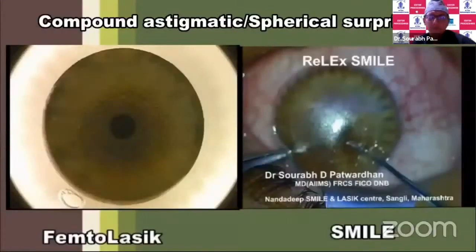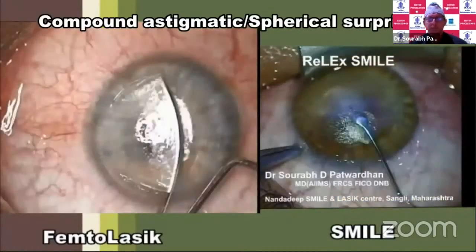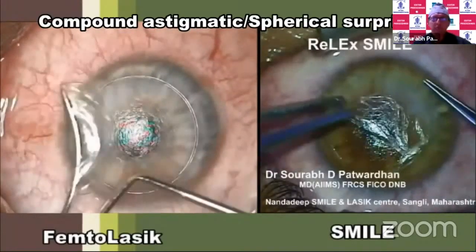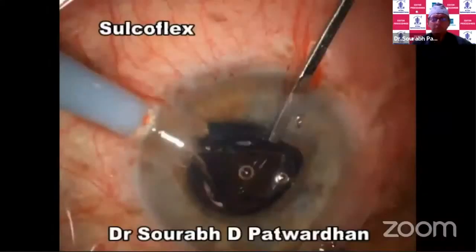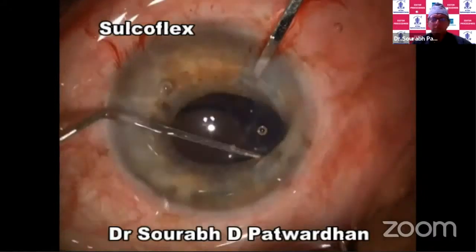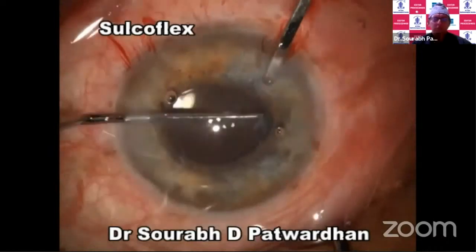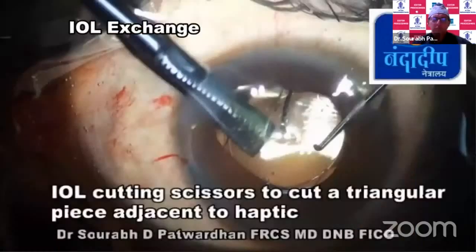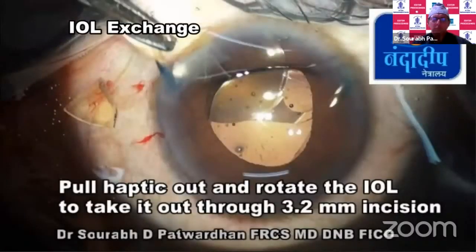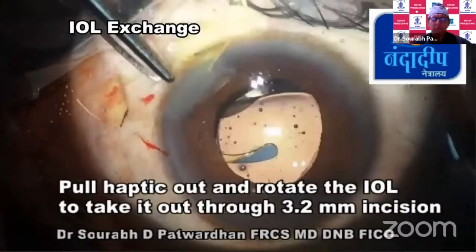To complete the list, there are other methods to deal with the compound astigmatic error or spherical surprises post-toric IOLs. We can simply do a corneal refractive procedure like surface ablation, femtoLASIK or SMILE. We can also do a piggyback IOL like Sulcoflex to take care of the residual refractive error. So if the error cannot be corrected by rotation of the IOL, I think we can do this. We can also exchange the old IOL and implant the properly calculated IOL to take care of the refractive error, and there are many other ways to do that.